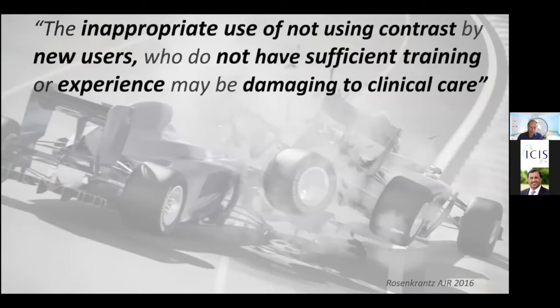Another warning, I can't warn enough, because I see in my country that too many radiologists are not using contrast because it speeds up things. You can do 3 per hour, it's easy, no contrast, no before and after contrast images, no comparison. It looks simple, but please consider that if you are a starter with not yet enough training, you may harm the patient. Don't do this when you don't have a driver's license.